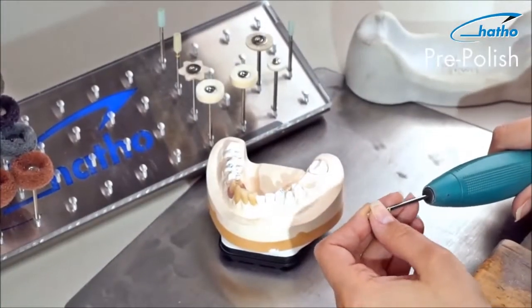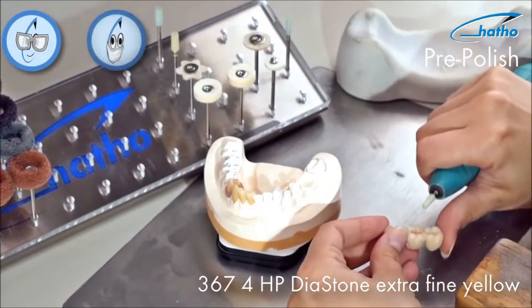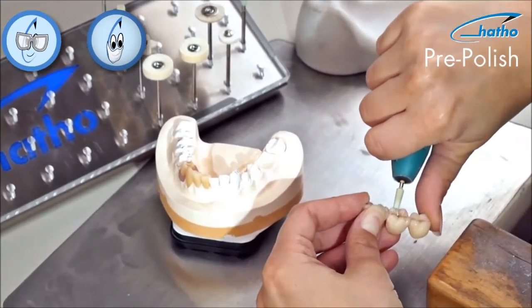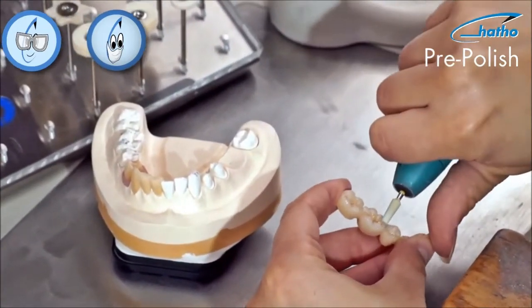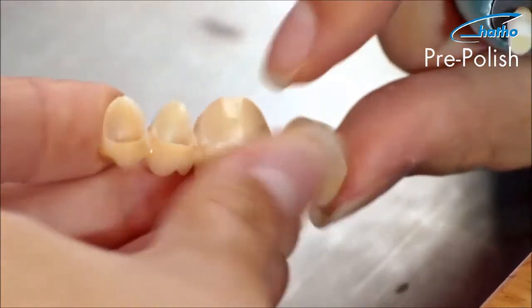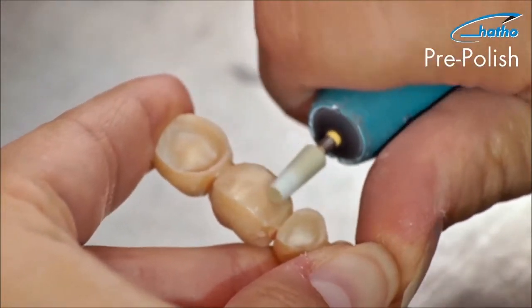The fine yellow color-coded diastone is used for pre-polishing. The diastone is so fine that one does not need to use any silicone polishers. As you can see, the basal surface made of zircon begins to shine immediately.